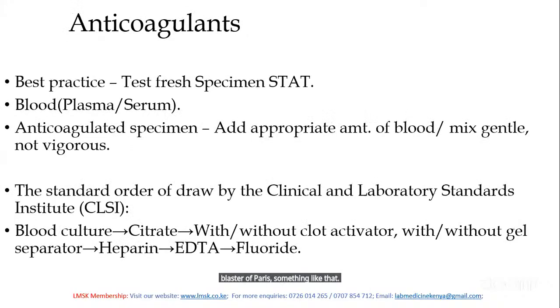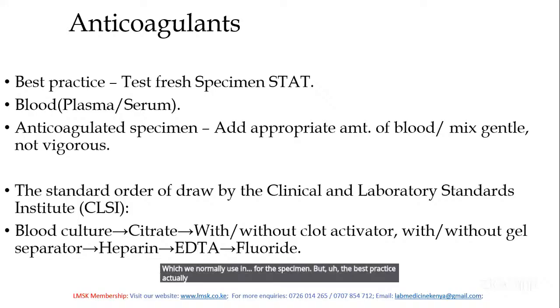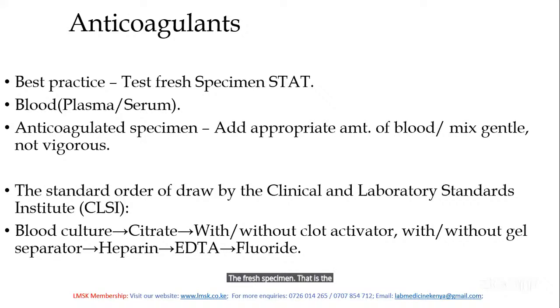So you've gotten your blood specimen. I want to introduce two anticoagulants, which we normally use for the specimen. But the best practice actually is you test the fresh specimen. That is the best practice for quality results. Test fresh specimen.